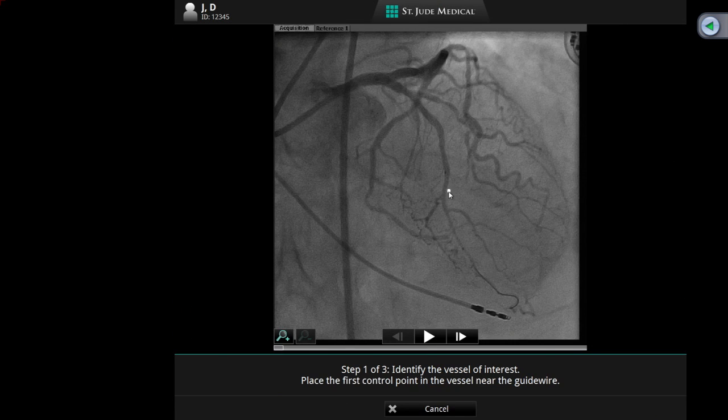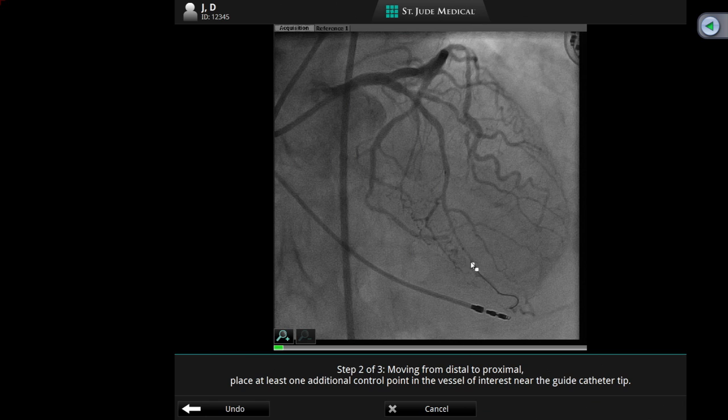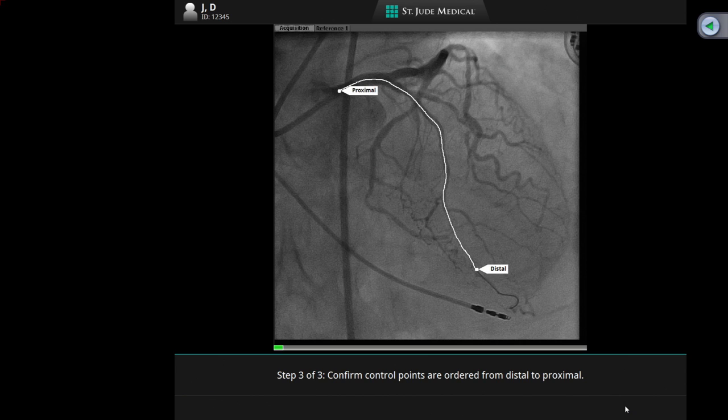Okay, let it come back. Don't go to the left wing. Okay. Chuck, some questions have come in for you, which I'll take after we do the OCT analysis. Okay.